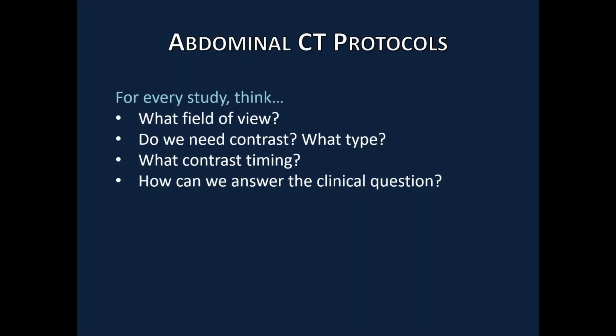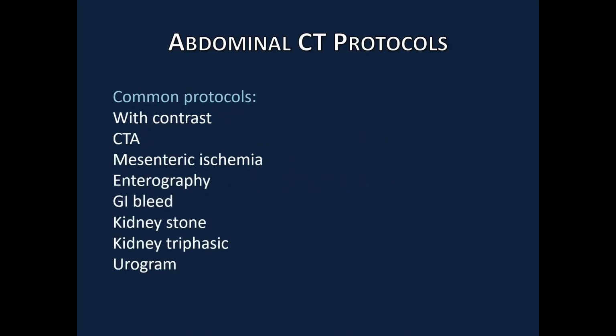When choosing an abdominal CT protocol, there are a few important things to consider. For every study, think: what field of view do I want? Do we need contrast and what type? What would be the best contrast timing? And overall, how can we best answer the clinical question, putting everything together?